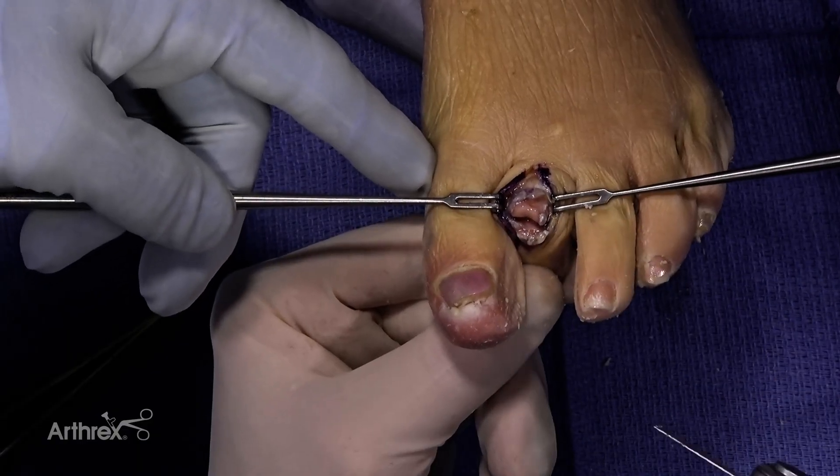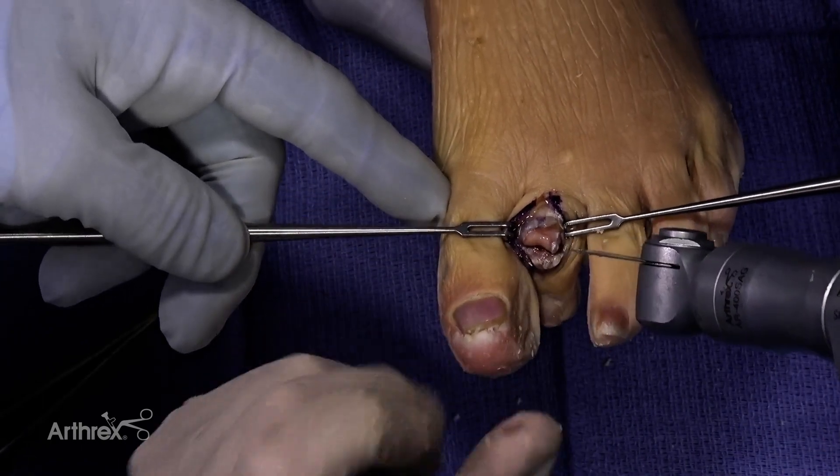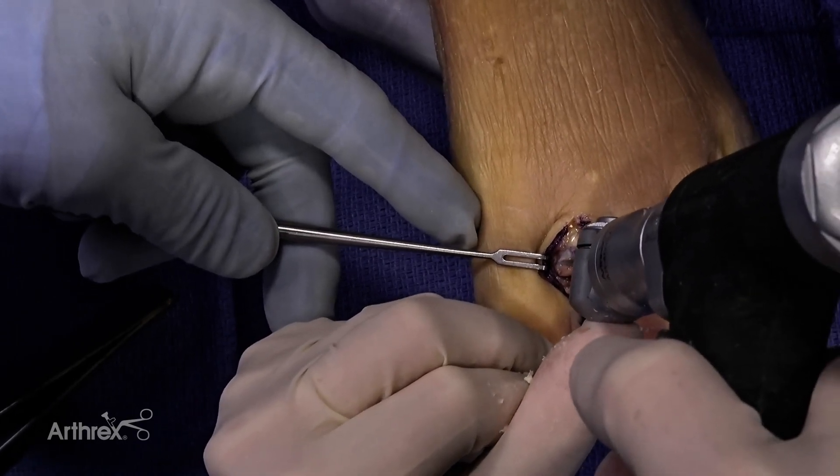With this implant, you can resect the joint however you prefer — using a saw, a couple of skin hooks to protect the skin, a rongeur or a bone cutter — up to your surgeon preference for joint resection. I'll use a saw today.